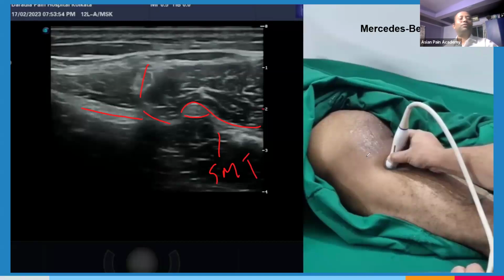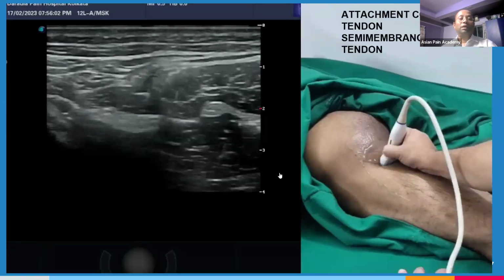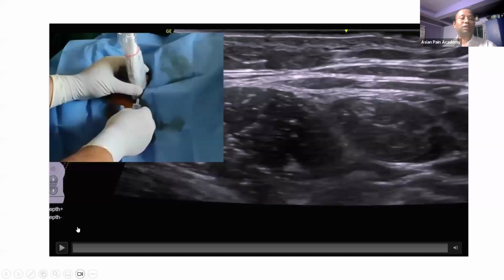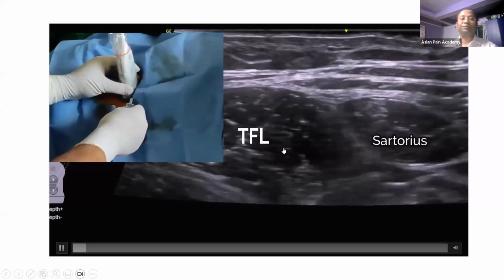Okay. So to understand the structure, you can start from below also, you can start from above also. Multiple other structures are also there, but I will not show more things. Some video section, just see.